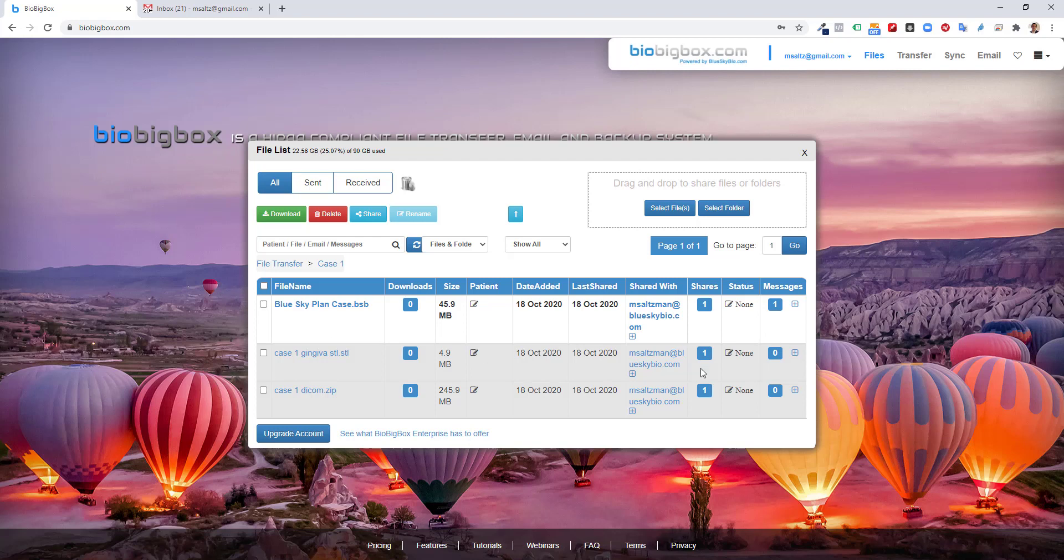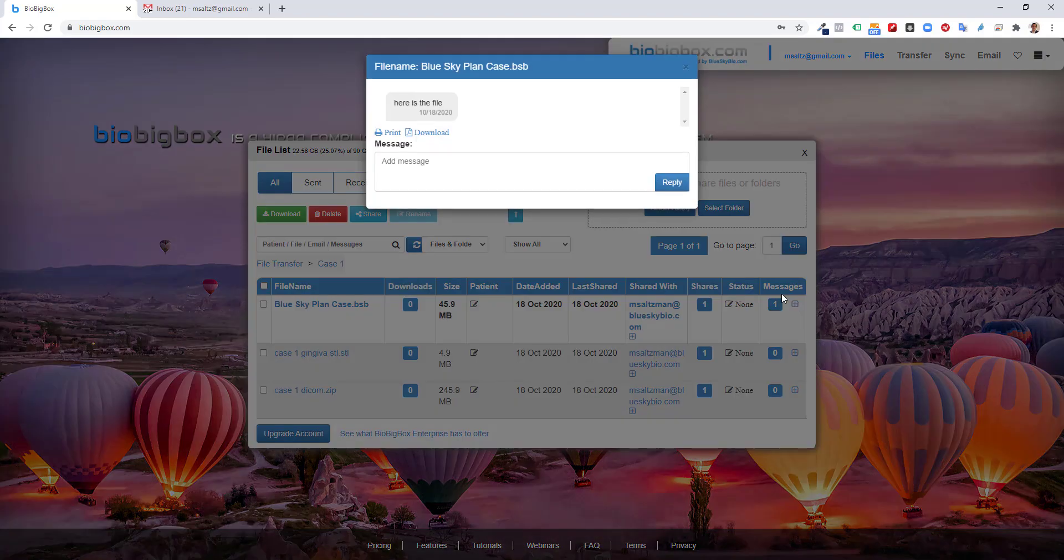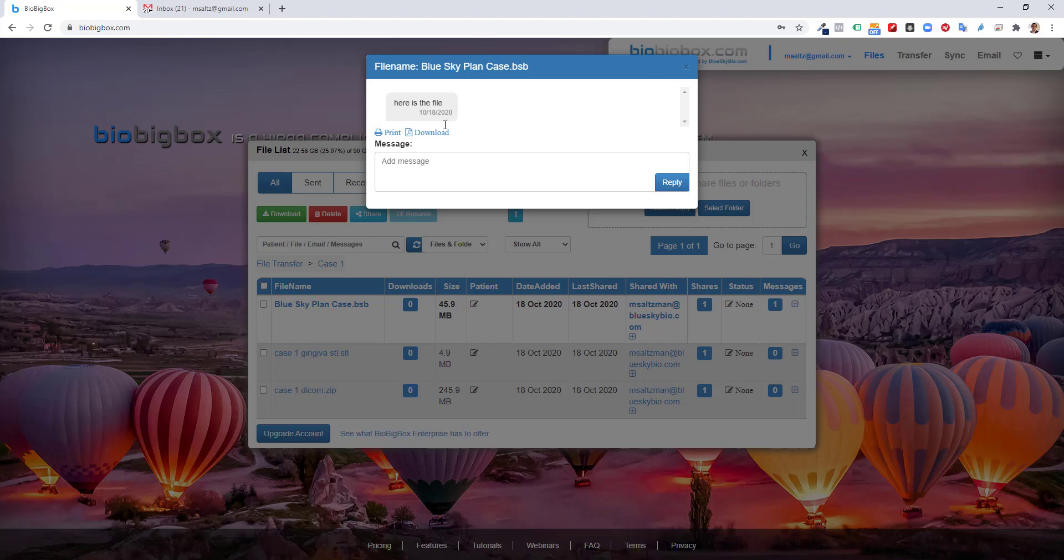We could also click on messages, and we could see the message here as the file. If he wants to respond, he could type in a message with a question, with a comment, and the other dentist or the lab will receive the message, and they could discuss the case via the messages, which is great because all of the messages for a particular case is attached in BioBigBox to the relevant case. So you could always go back and see what was discussed, what were the comments, etc.